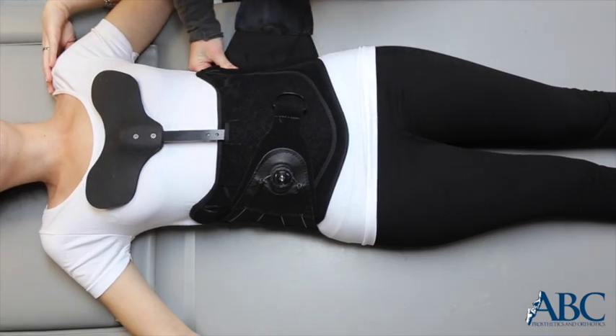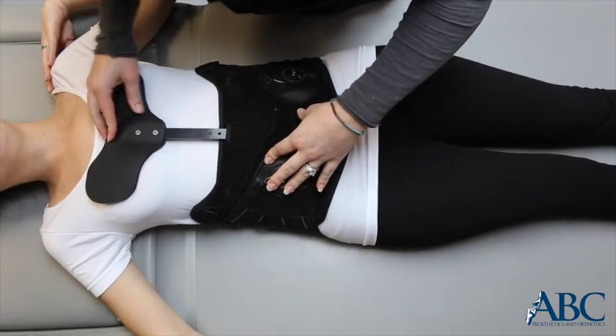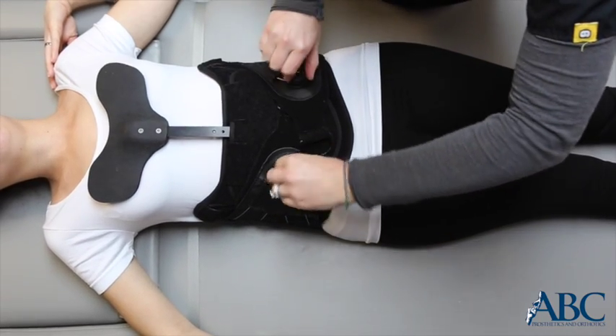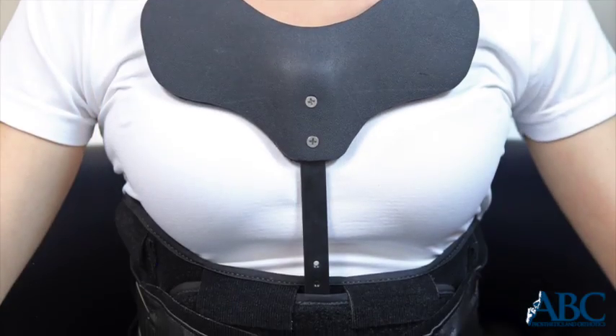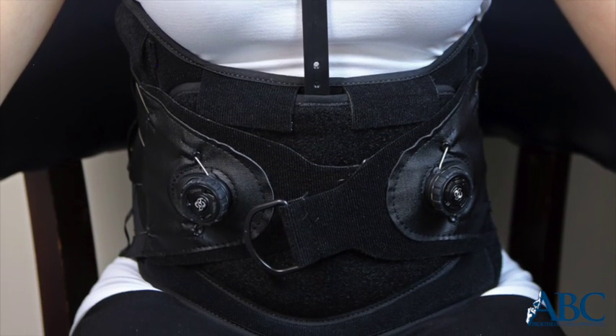Secure the Velcro straps one at a time, pulling out and up in a wrapping motion. Engage the BOA fastening system by pushing the button down and twisting the knobs clockwise until the brace is snug. The brace should be tight enough that it does not migrate upward once sitting.